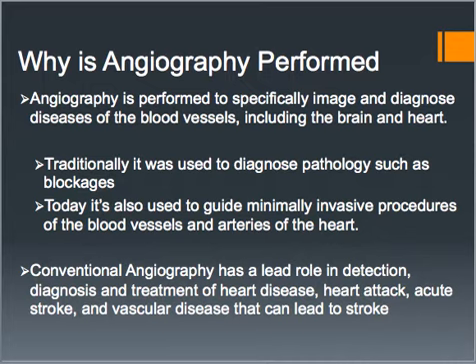So diagnostic vascular imaging is often using CT or MR, sometimes even ultrasound. And X-ray angiography is also used for therapy as well. So X-ray angiography has a vital role in the detection, diagnosis, and treatment of heart disease, heart attacks, acute strokes, and vascular disease, which can lead to strokes.